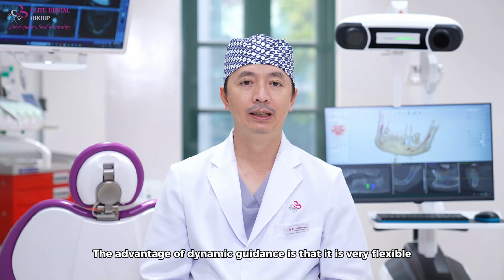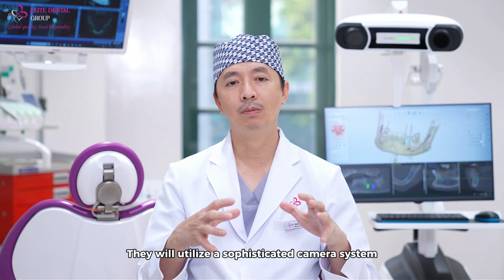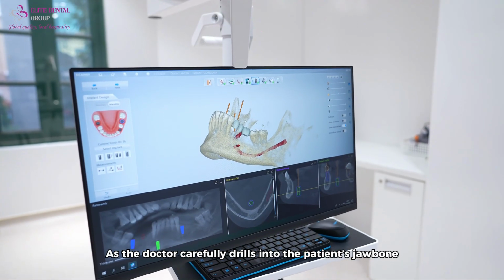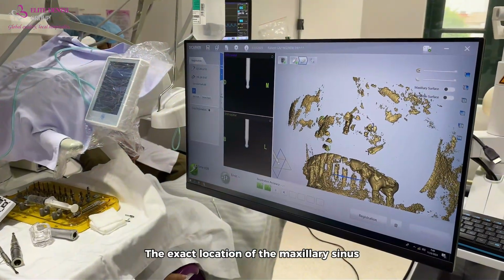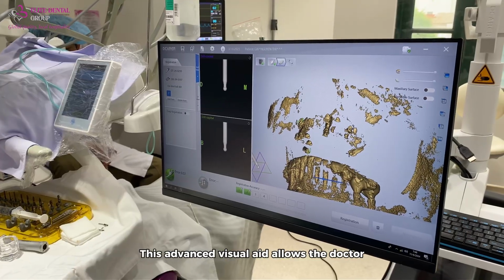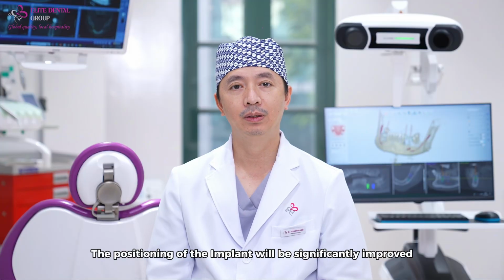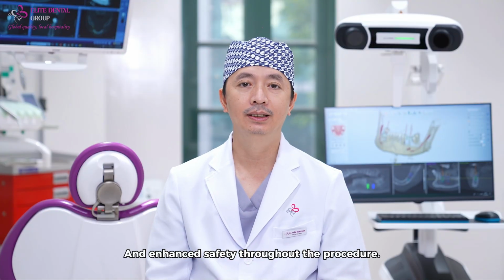The advantage of dynamic guidance is that it is very flexible. When the doctor performs the implant procedure, they will utilize a sophisticated camera system that is connected directly to the patient's jawbone and the implant drill. As the doctor carefully drills into the patient's jawbone, they can observe the precise position of the jawbone, the exact location of the maxillary sinus, and the surrounding nerves displayed clearly on the monitor. This advanced visual aid allows the doctor to adhere closely to the initial surgical plan. Consequently, for the surgeon, the positioning of the implant will be significantly improved, ensuring greater accuracy and enhanced safety throughout the procedure.